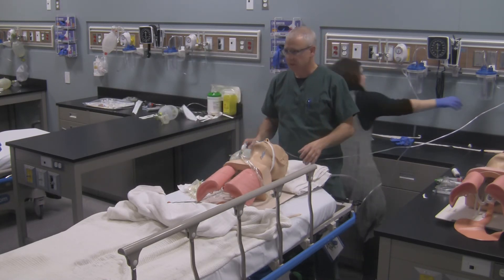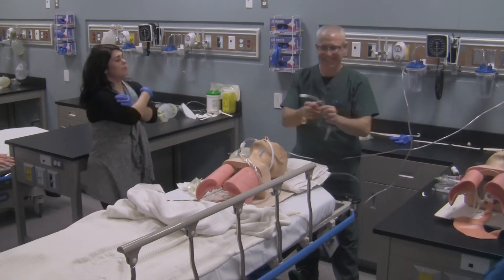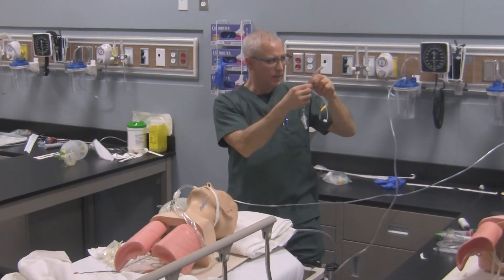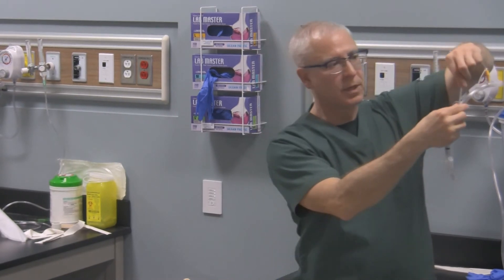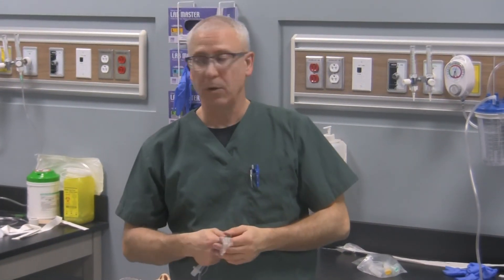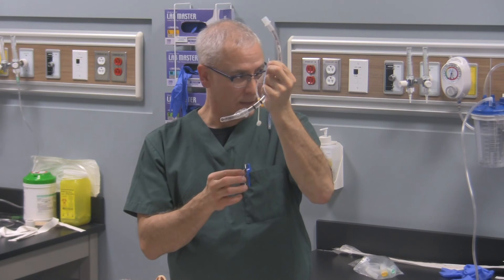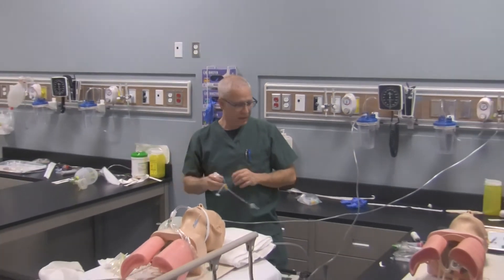Your evac tube is going to have a second catheter. When taping tubes in place, try not to tape the pilot balloon line or the evac tube to the tube itself — your tape goes around the tube, not around the evac portion. Why? You don't want to block it off. If you apply a lot of pressure to the evac catheter, you could compress it. If the tape compresses it, you can attach your suction all you want but nothing will come out. Don't tape the pilot balloon line to the endotracheal tube either — it could get kinked off and you wouldn't be able to use it.